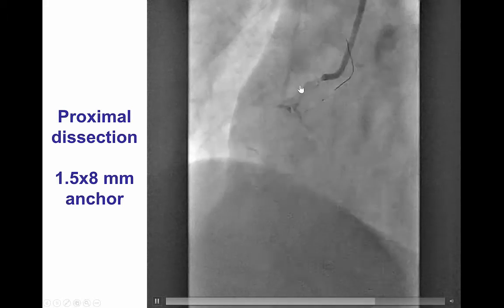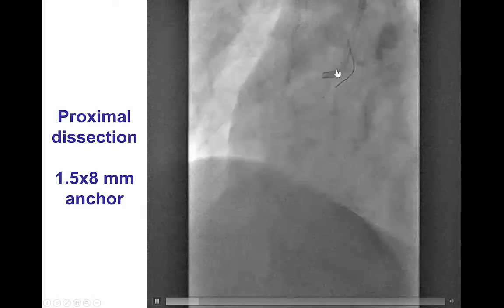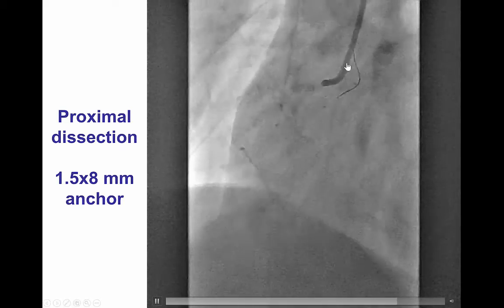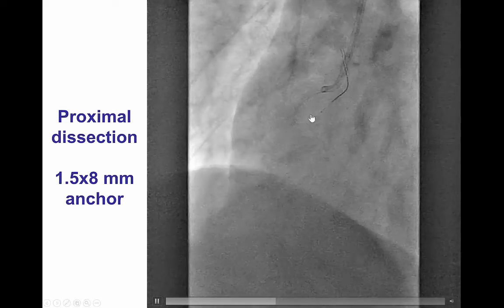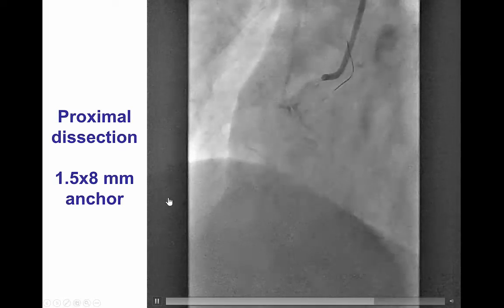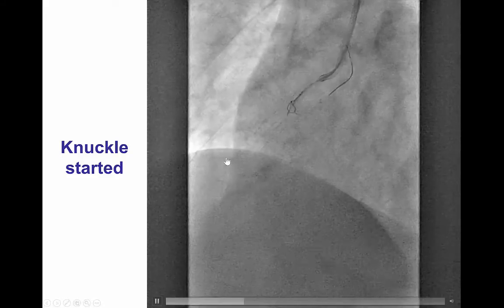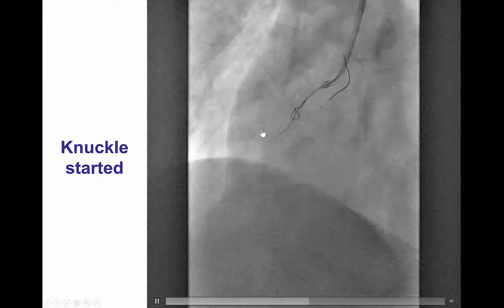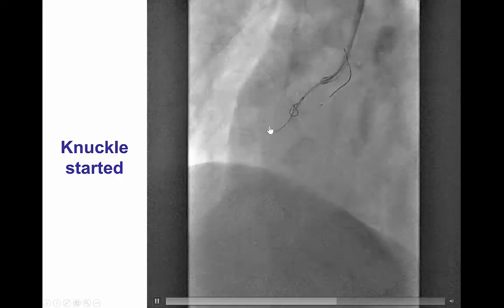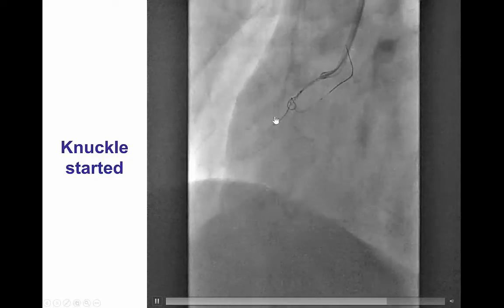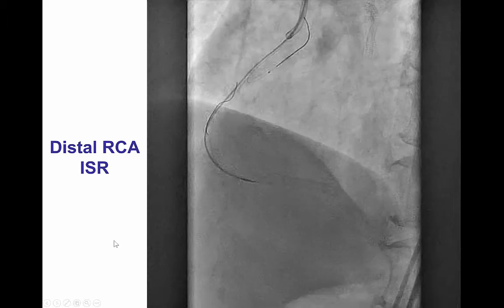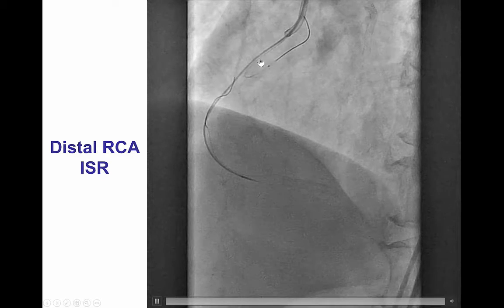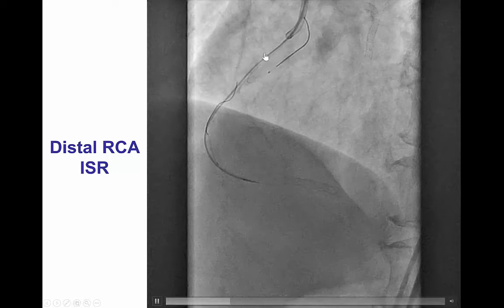After causing the dissection in the proximal RCA, we had to change the guide catheter due to support issues — switching to an AL1. This is a GR4 guide catheter with a side branch anchoring balloon keeping the guide catheter in place. After causing the dissection, we were able to advance a knuckled Fielder XT guide wire into the dissection plane, tracking down the course of the right coronary artery, which allowed us to cross very rapidly through that ambiguous proximal cap area.